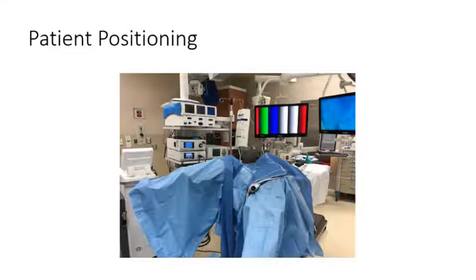The ureteral access sheath is passed into the ureter based on the location of the stone. Then the flexible ureteroscope is passed under fluoroscopy guidance up to the level of the stone. The stone is visualized. With the holmium laser at the setting which is shown previously, the stone is then dusted to small dust particles, making sure that the stone does not migrate into the proximal ureter.